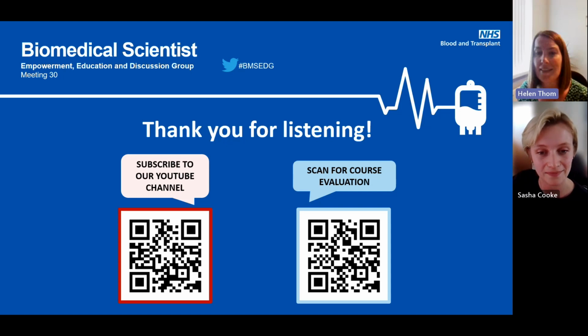Someone's asking there if we'll keep little K negative units in the frozen blood bank. There will actually be units in the frozen blood bank that are little K negative, but I don't know how many we would keep. And with something like that, even though it's a high incidence antigen, you do get the odd one sort of floating around. I mean, this one, if you think they had to be big C negative, but they also had to be Jka negative as well, so it sort of decreased that.